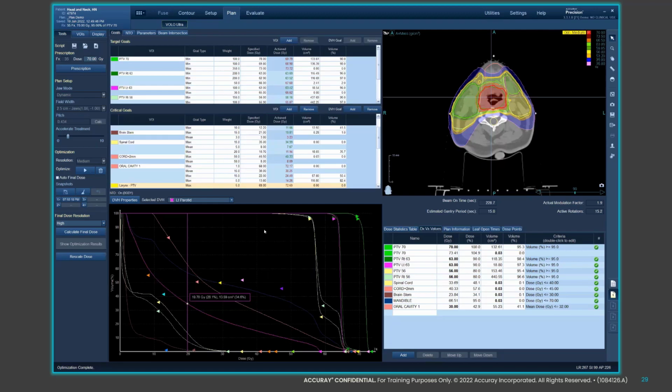So overall, not only is VOLO Ultra going to significantly improve your planning time, but most likely it's going to speed up your beam-on times and improve the quality of your plans. Essentially, these improvements can affect many aspects of your clinic, from the dosimetrist workflow process to the therapist treatment schedule, and most importantly, the quality and time of each of your patients' delivery plans.